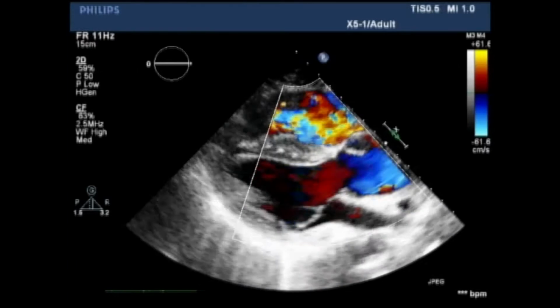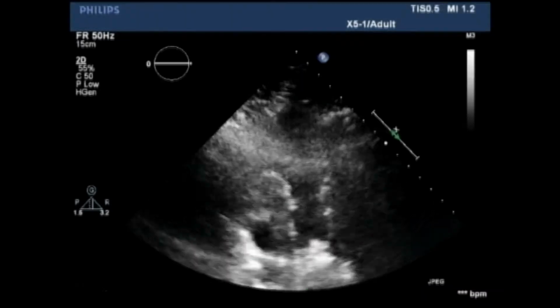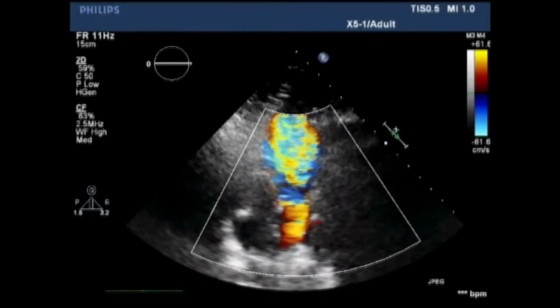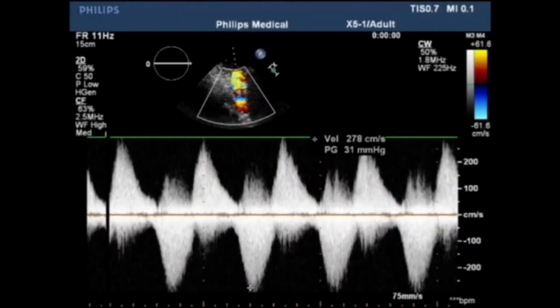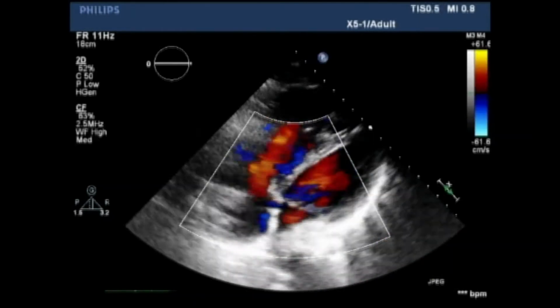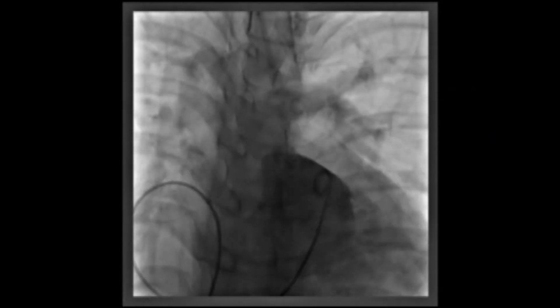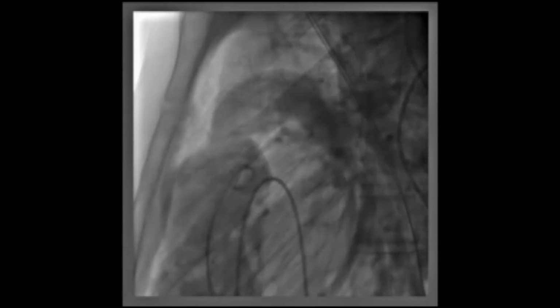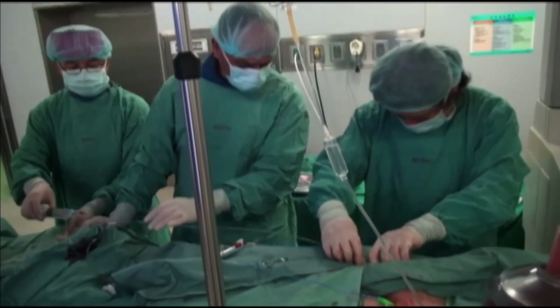And this is the pre-transthoracic echo I did. We found that there was a severe PR, and we measured the MPA diameter and the length of the MPA, so we can decide what kind of valve size and length we should pick. The color Doppler shows severe PR, and the CW shows the shape of free PR also. There is a mild plus TR. Then we do angio, we can see significant pulmonic regurgitation, and the MPA and the RPA, LPA, no stenosis.